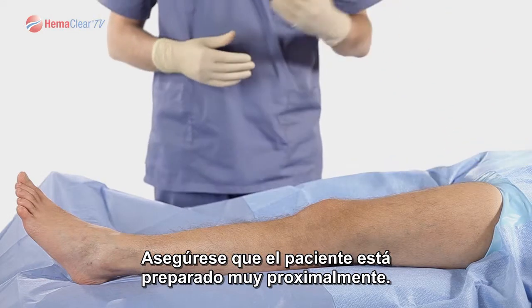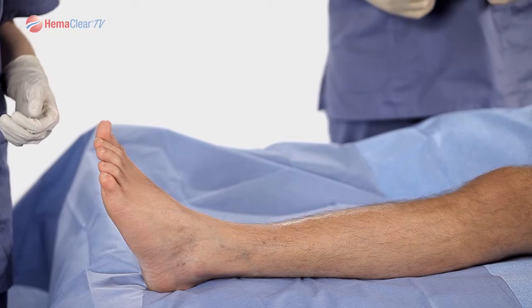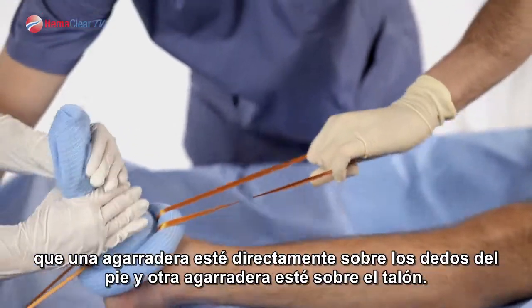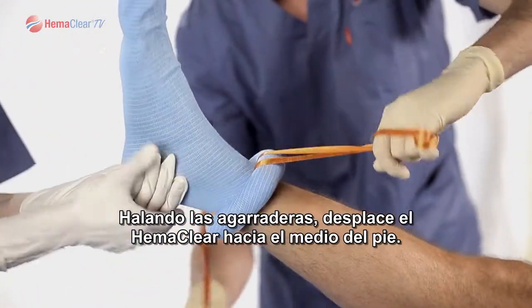Take notice that the patient is prepped very proximately. Place the patient's leg flat on the table. Next, the Hemoclear device should be placed so that one handle is directly over the toes and one handle is directly over the heel. Pulling the handles, advance the Hemoclear to the mid-foot.